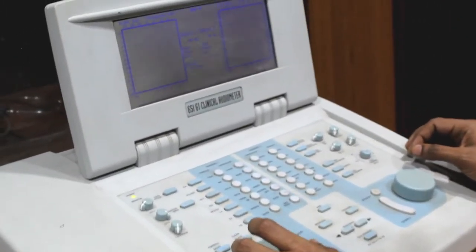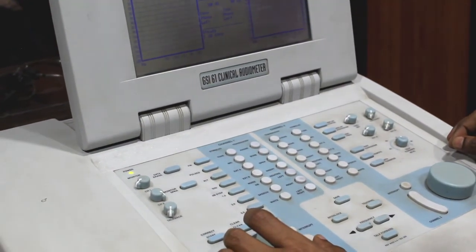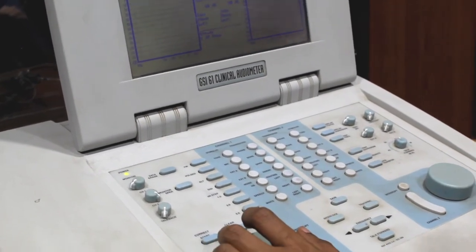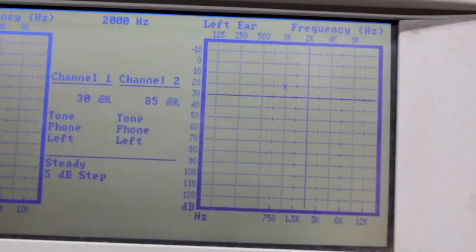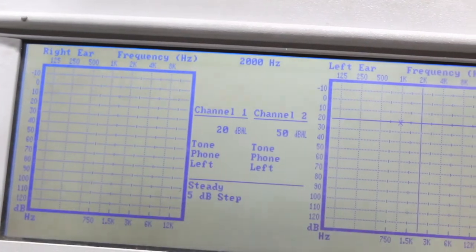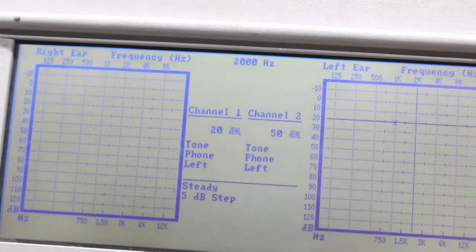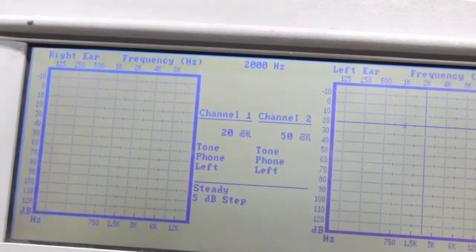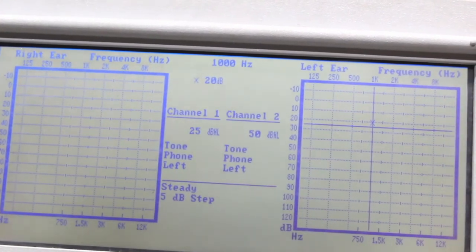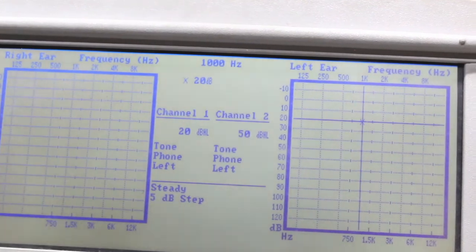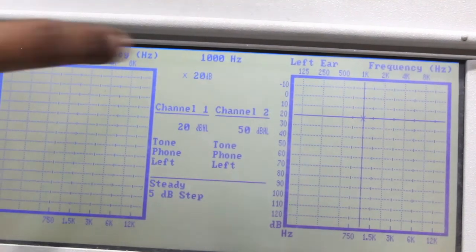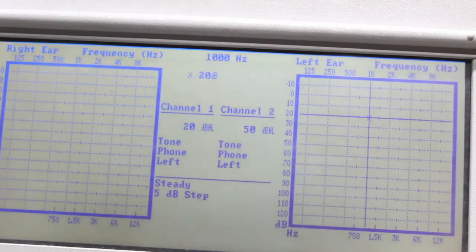This is also done for bone conduction. After that, results are plotted in the audiogram with symbols. For example, at 1,000 Hz marked at 20 dB for the left ear, then changing to 2,000 Hz and so on. If desired, this can be plotted on the paper audiogram graph as shown earlier.